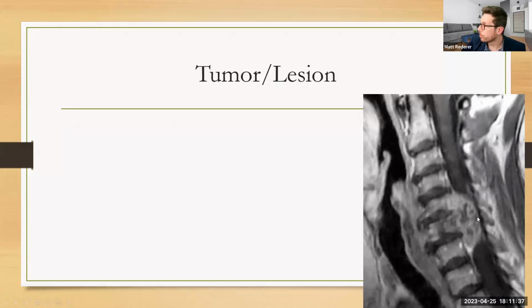Here's a huge tumor on there. So I believe I scanned this one, and I believe that this patient was unable to feel their hands, I think. I want to say there was something extreme. That's a tumor coming off into the spinal canal, pushing on the spinal cord.